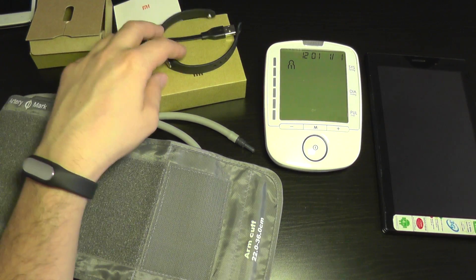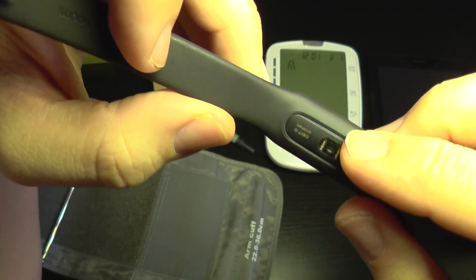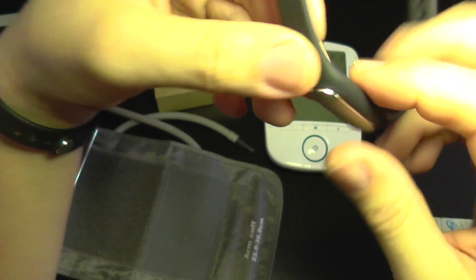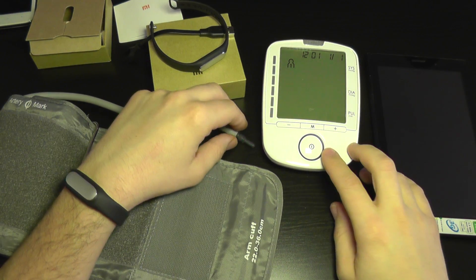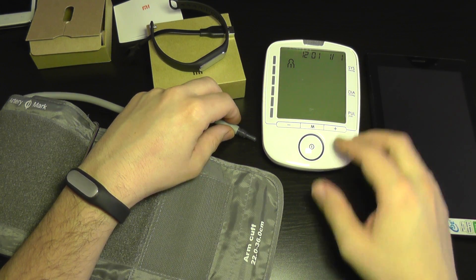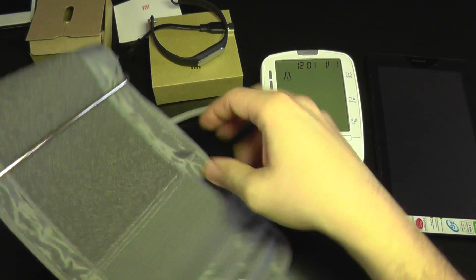I'm going to test the accuracy of the Mi Band 1S. The sensor is here. I want to see how it compares with the conventional blood pressure monitor, which also has a monitor for pulse. So I'm going to install the arm cuff.